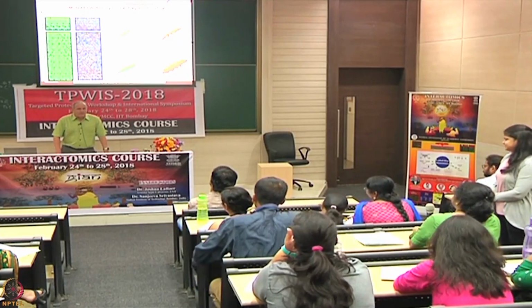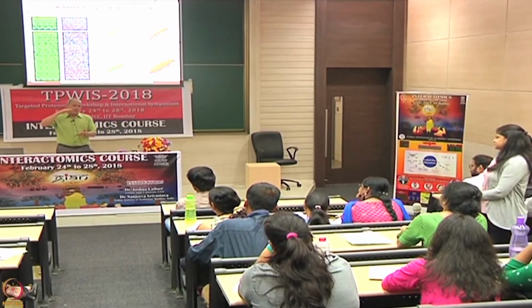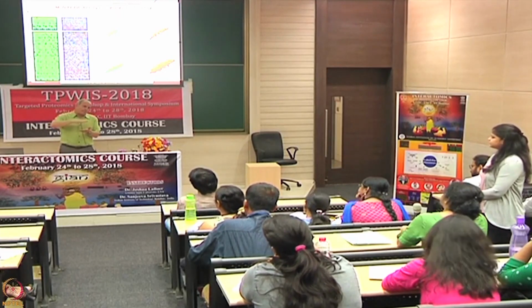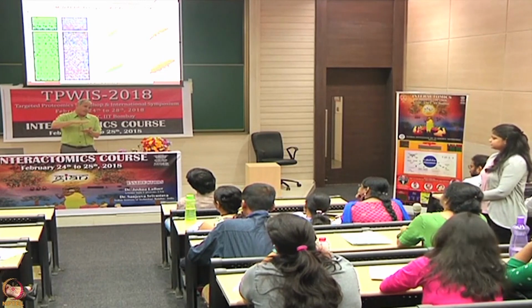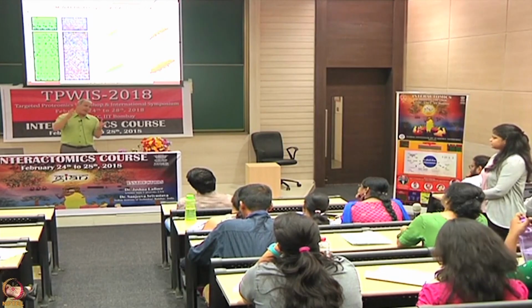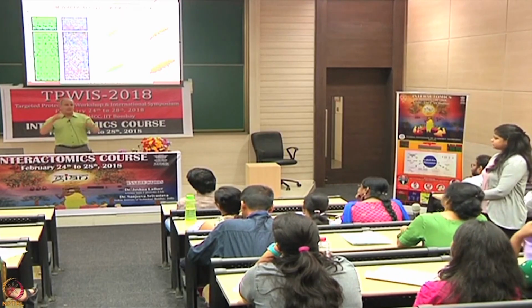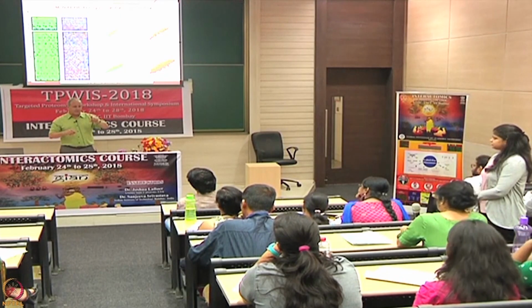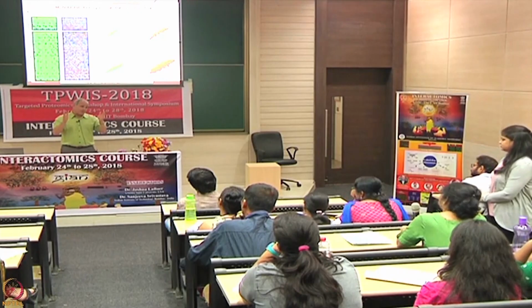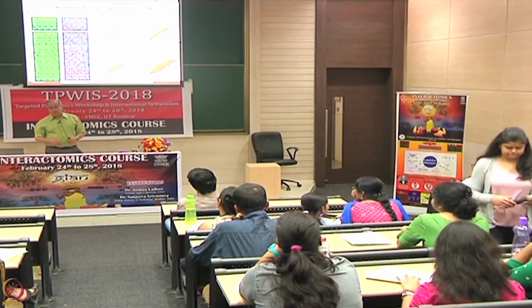So the idea was, and I don't remember exactly what our final print concentration is these days, I think it's like 200 or 300. They took the standard concentration, cut it by a quarter, and then mixed that together with the other ones. If you just mix 1 plus 1 plus 1 plus 1 plus 1, then each one becomes 1/5 of the concentration, and the overall concentration is still the same if they're all at the same concentration. So that's in fact how he did it. It's a good question though.